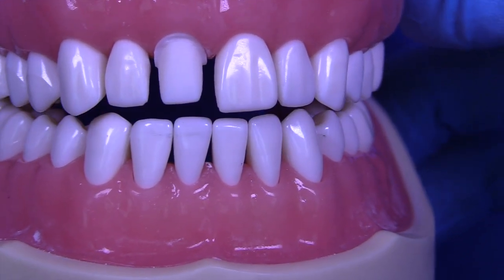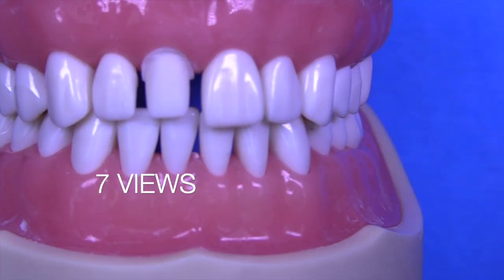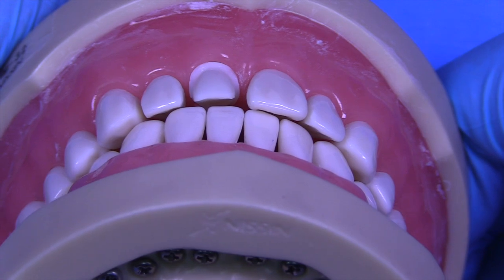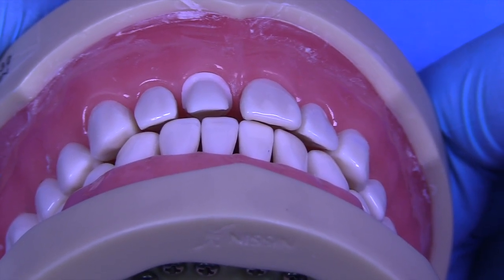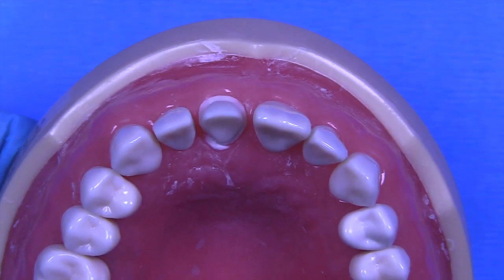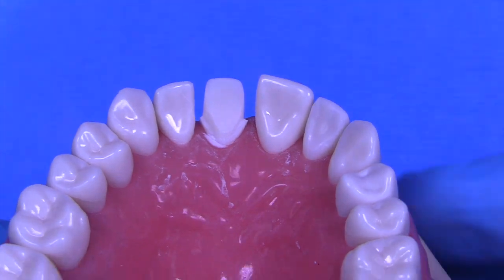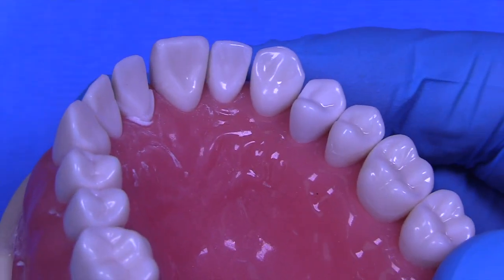And the first thing I like to look at, and there are really 7 views we like to look at, okay? View number 1 is from the facial. View number 2 is from the underside, like this sort of angled upward view. The third view we like to look at is from the side. The fourth view is from the occlusal, or the incisal view. Then we like to look at the straight lingual view, and then we like to look at the distal view and the mesial view.